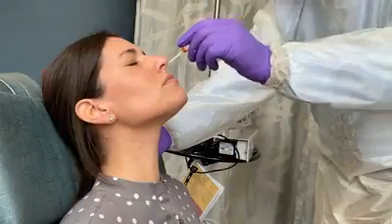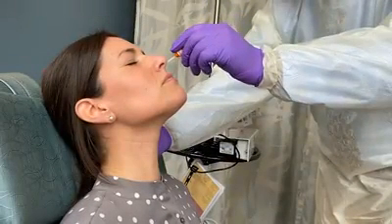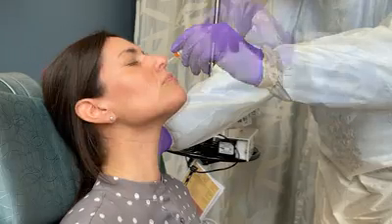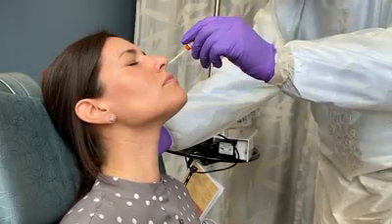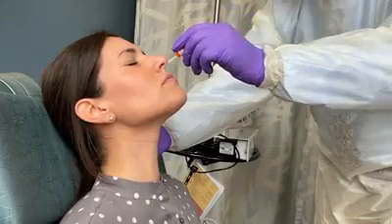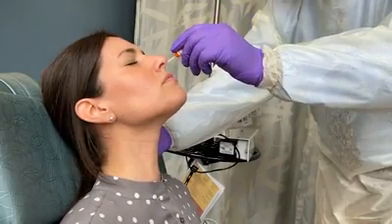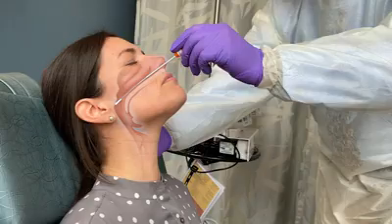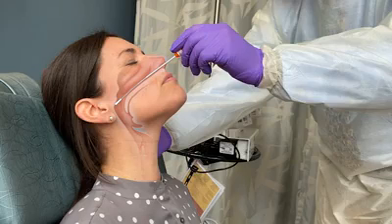Gently insert the swab along the nasal septum, just above the floor of the nasal passage, to the nasopharynx, until resistance is felt. If you find resistance to the passage of the swab, back off and try reinserting it at a different angle, closer to the floor of the nasal canal. Insert the swab into the nostril parallel to the palate. The swab should reach a depth equal to the distance from the nostrils to the outer opening of the ear.